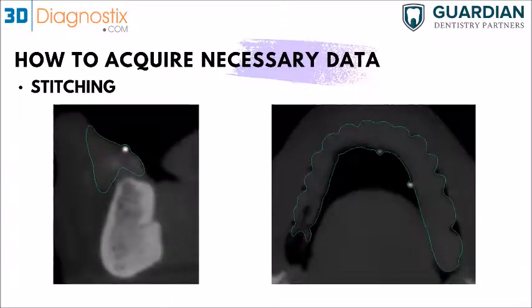And then once we've got the patient scan, we take out the denture, scan the denture alone, and make sure that the position of the radiopaque markers are exactly where they are. And then we take those 2 DICOMs and we stitch them together. And as you can see in those pictures, we've got the radiopaque marker in the scan. You can see it very clearly here. And then you can see that this is the outline of that radiopaque marker.